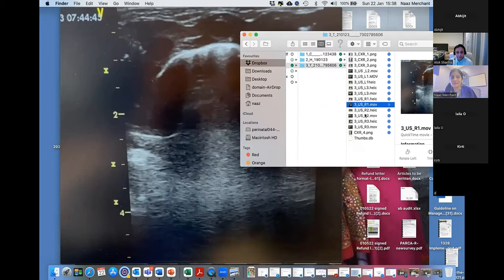Very nice image. Really? Because I don't have any presets, so I just used the initial lung preset, which was there, though I'm not even sure exactly. It's giving us all the information we need. So it's a good image in terms of your delineation. Superficial structures are visualized very nicely. The pleural margin is visualized very nicely. What we've obviously got, when we've taken the depth in, is a little bit of artifact at the bottom, but that's not a problem.